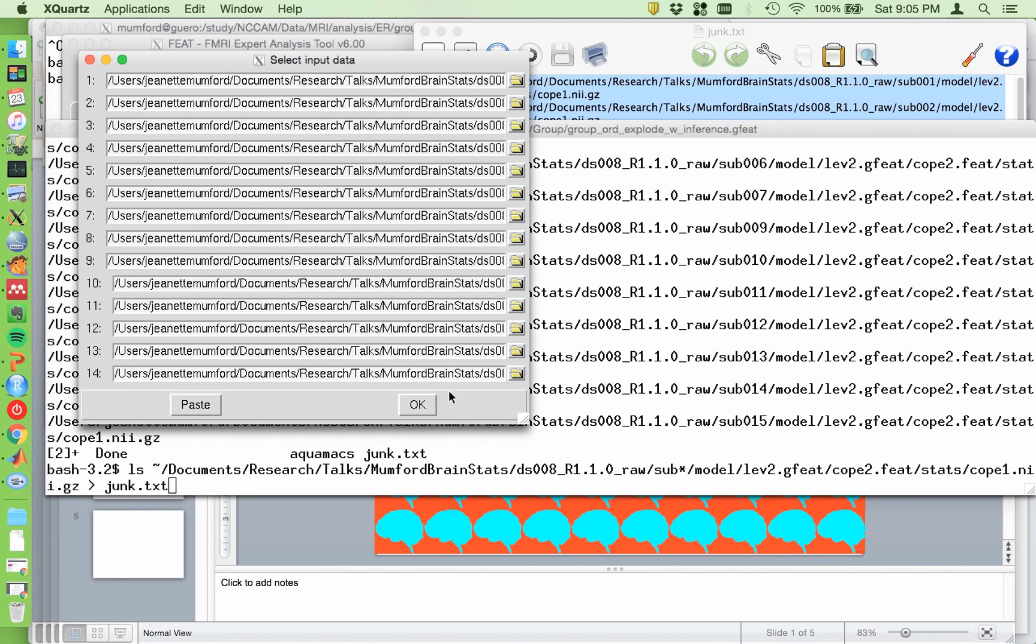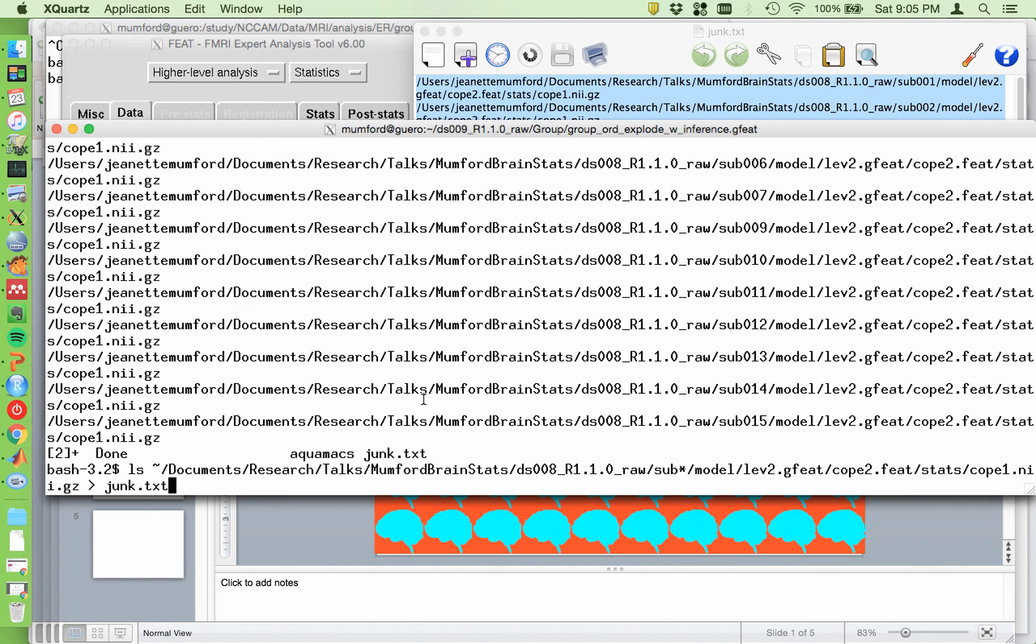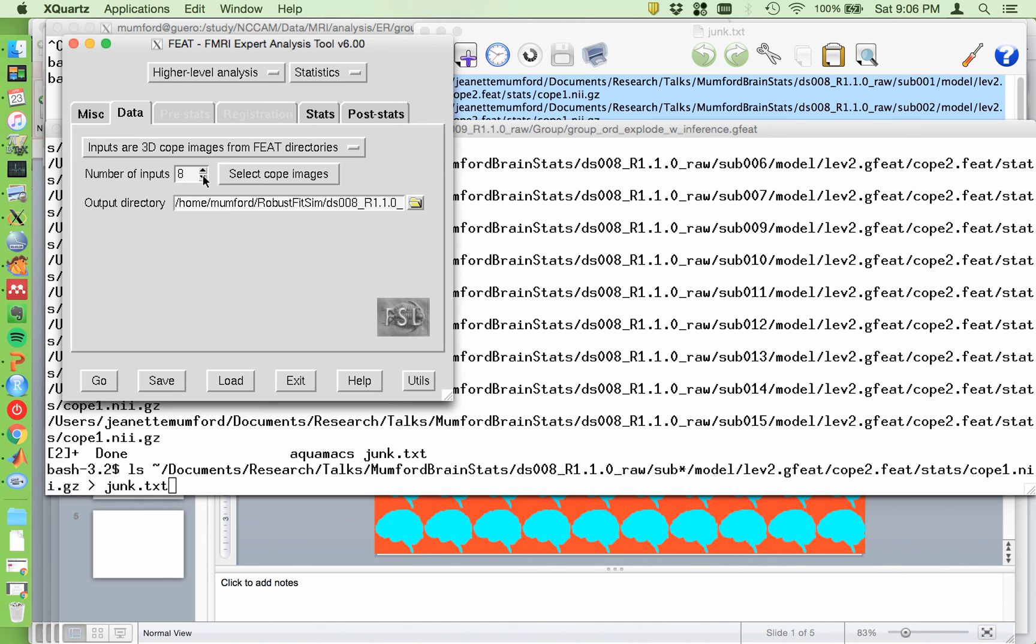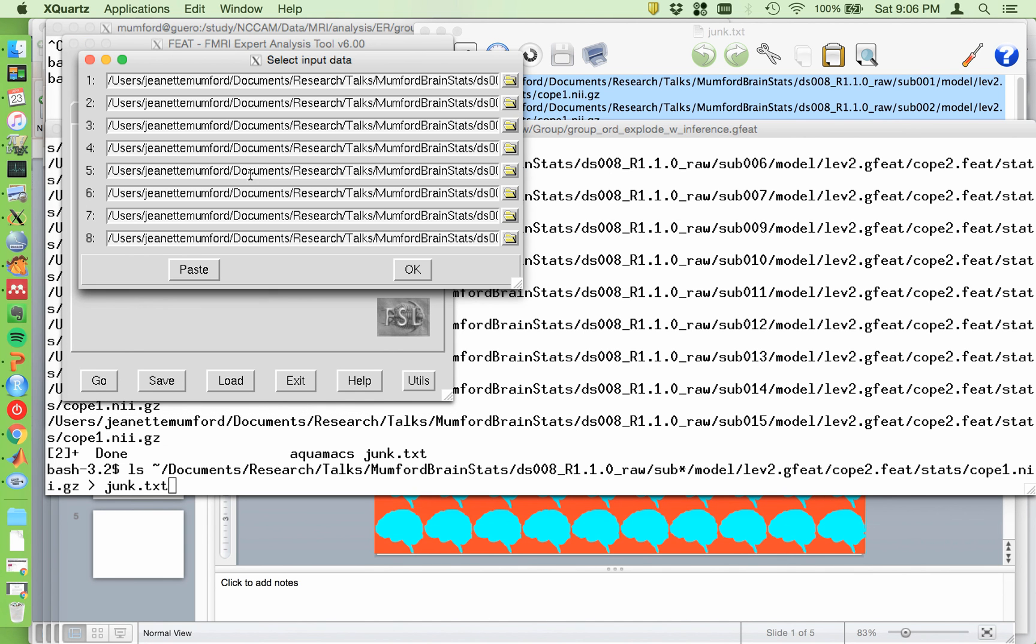And then it pasted them into here. Hit OK. And if any of your paths were wrong, FSL will complain. So when that happens, sometimes it's a pain to figure out which one's causing it. So I'll start by cutting this to seven. Like if you just if you cut this down, say to eight and hit select cope images, it automatically takes the first eight. So I'll try these and hit OK and see if I get an error message.